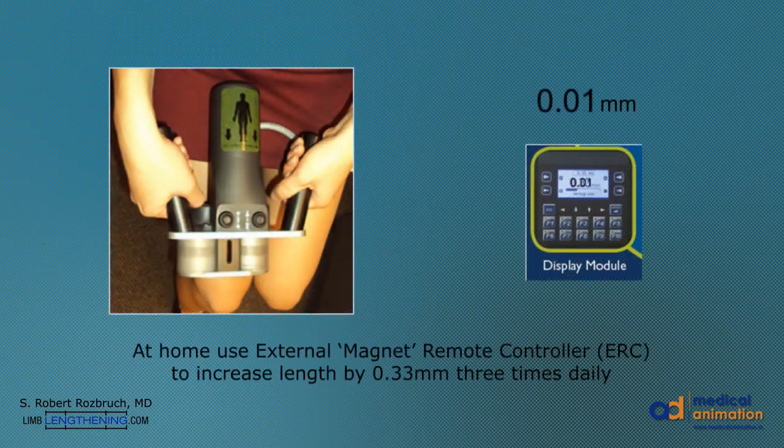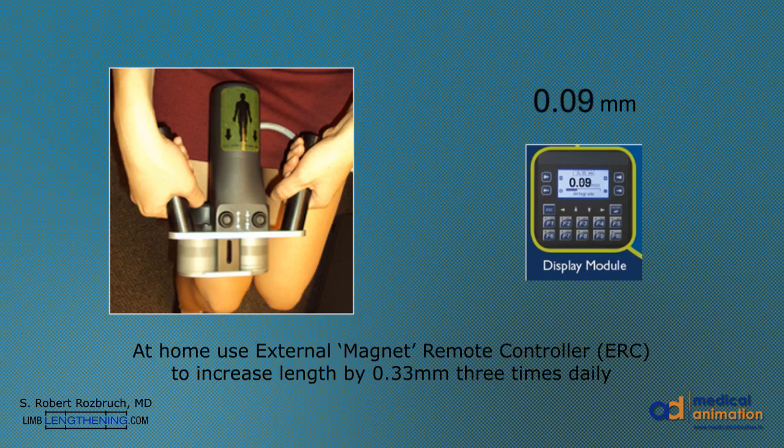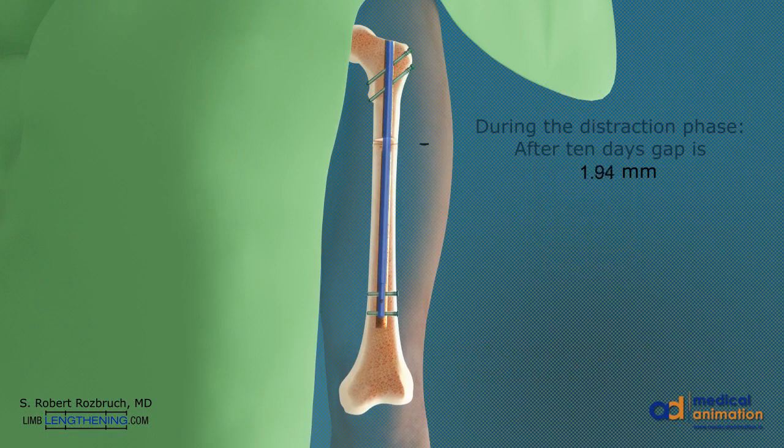At home, the patient uses the external magnet controller to typically lengthen the bone one-third of a millimeter, three times per day, equaling one millimeter per day. After 10 days, there is 10 millimeters of length added.